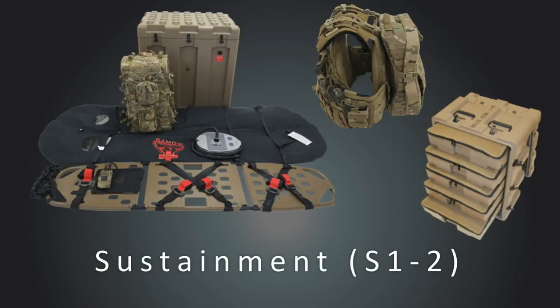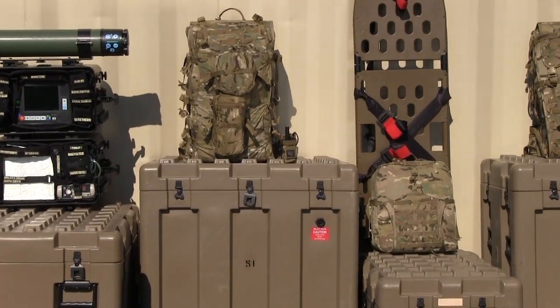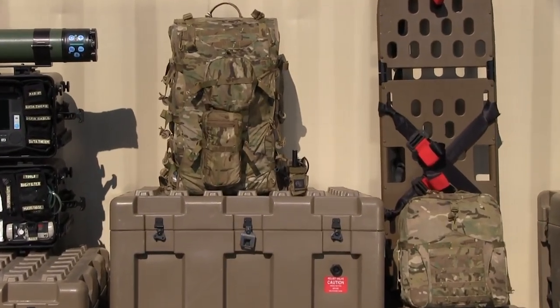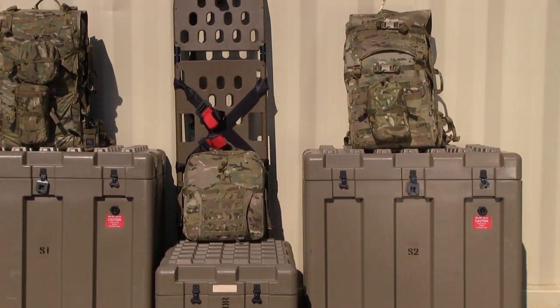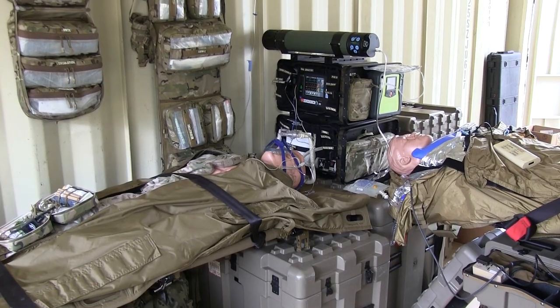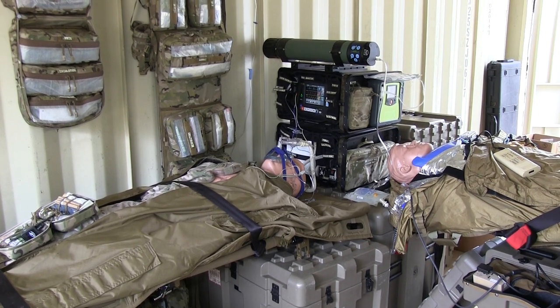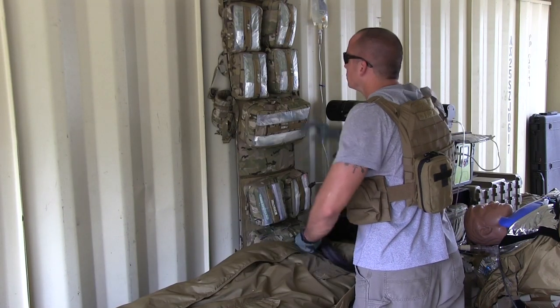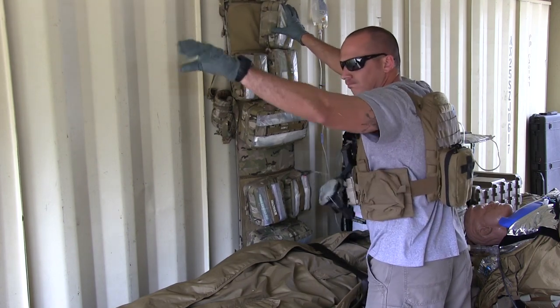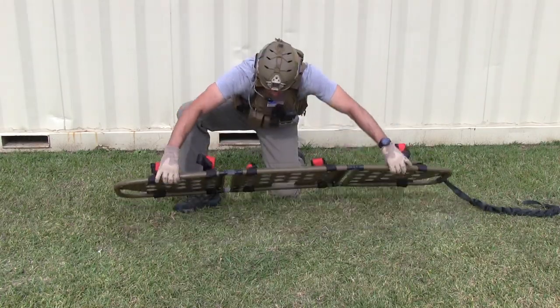The sustainment category is broken down into two modules, S1 and S2. This category is intended to add bulk supplies and additional capabilities to the overall set, allowing for the care of two to five patients for up to 72 hours. The S1 module is built around a custom pack system that unfolds into a supply sheet, allowing for wall hanging. The individual pockets on the sheet have semi-clear windows and are removable for individual patient care. A Mantis tri-fold board adds additional evacuation capabilities.